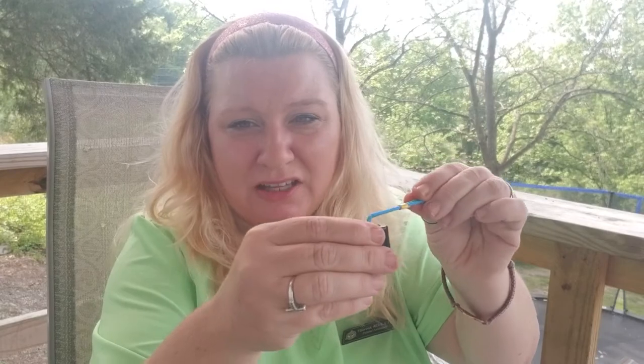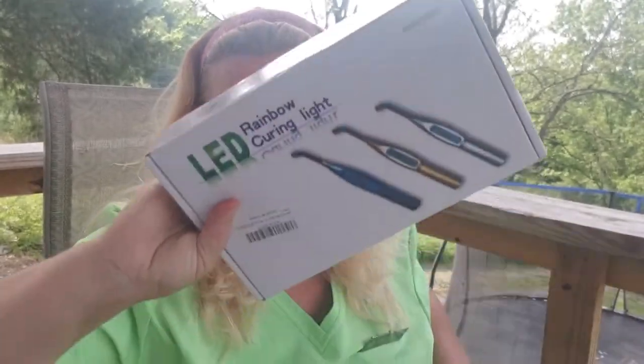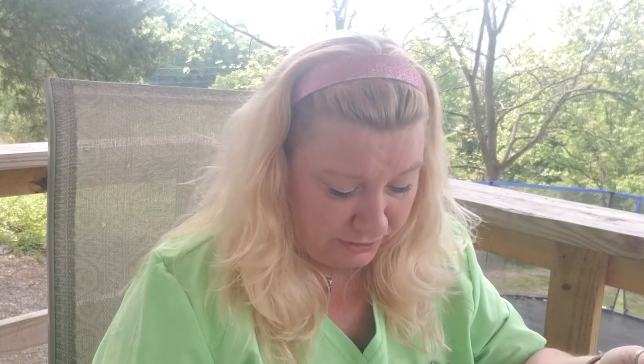You can dip the brush in and hand it to them like this, holding it so they grab it and have more if they need it. They're going to spread a little bit just to spread that adhesive onto the tooth. Then they will light cure it with the curing light, or you will be holding the curing light. Remember to look through the shield — never look at the blue light, even though it's pretty. Over time, just like with radiation, it will ruin your eyes. If your patient can see the light, let them know. It's always nice to give your patient safety glasses for any of the procedures.